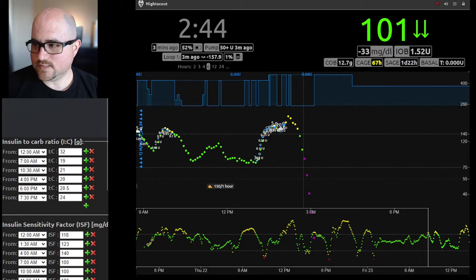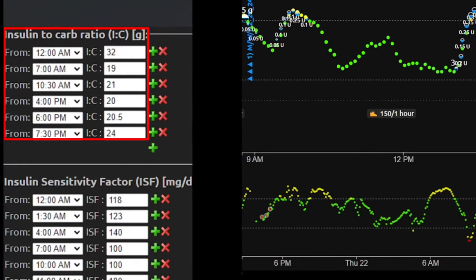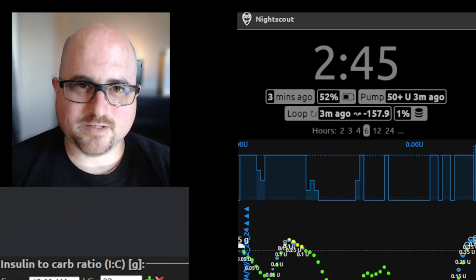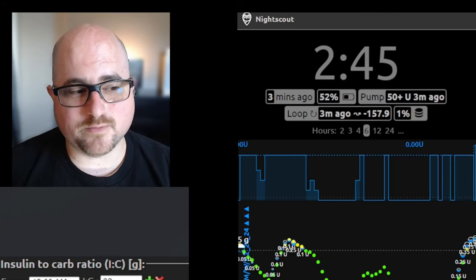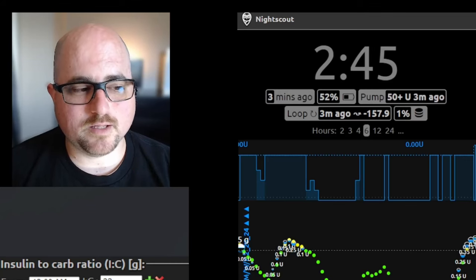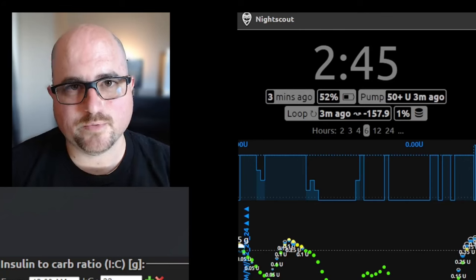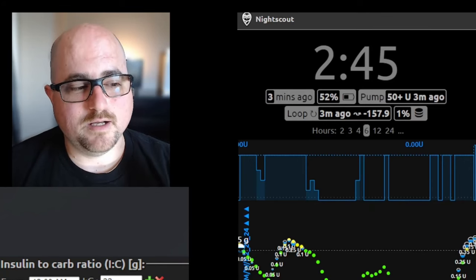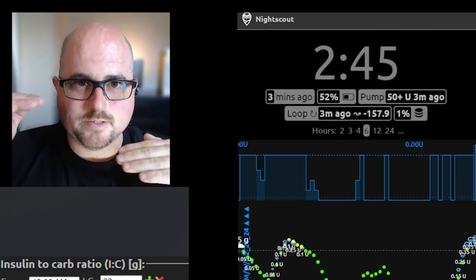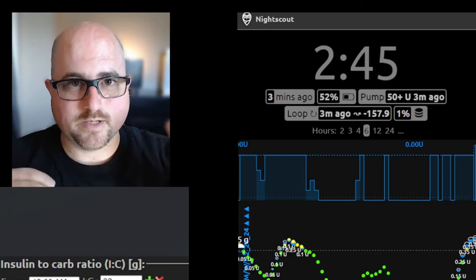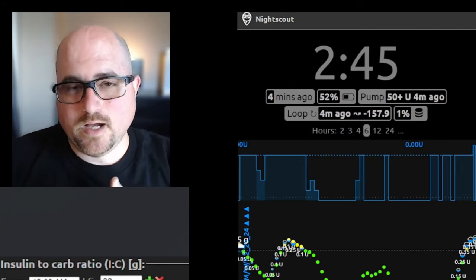These ratios — hopefully you guys can see the carb ratios now: 19, 21, 20. I would say on average these are pretty weak. For a 12-year-old, if I'm going off the assumption that the basal rate is going to be right around the 0.3 to 0.4 range based on the overnights, that's pretty low. You're not dealing with a lot of puberty insanity just yet in terms of hormones affecting blood sugar. Since you're on the lighter side possibly for basal needs, it makes sense the carb ratios would be a little light — but I would think they're probably going to come down if you end up reducing basal during the day. You'll end up trading your basal and your carb ratios: basal will come down and carb ratios will also come down, so you're getting more insulin in the bolus and not just in the background as basal.